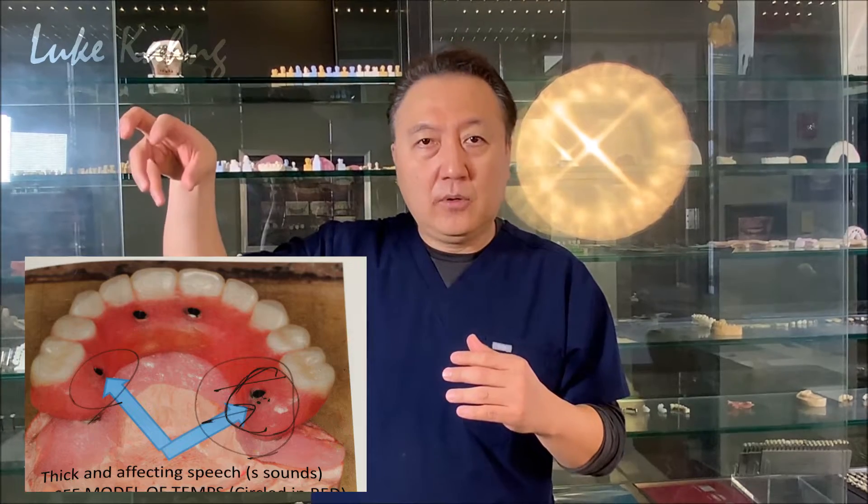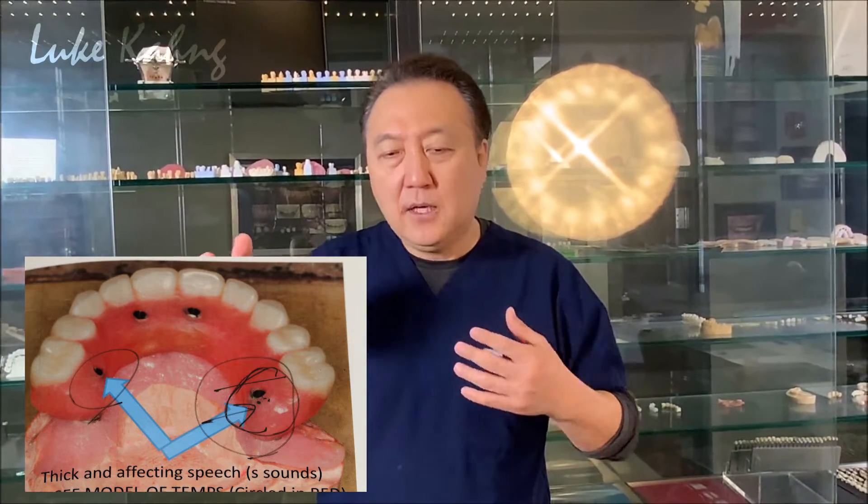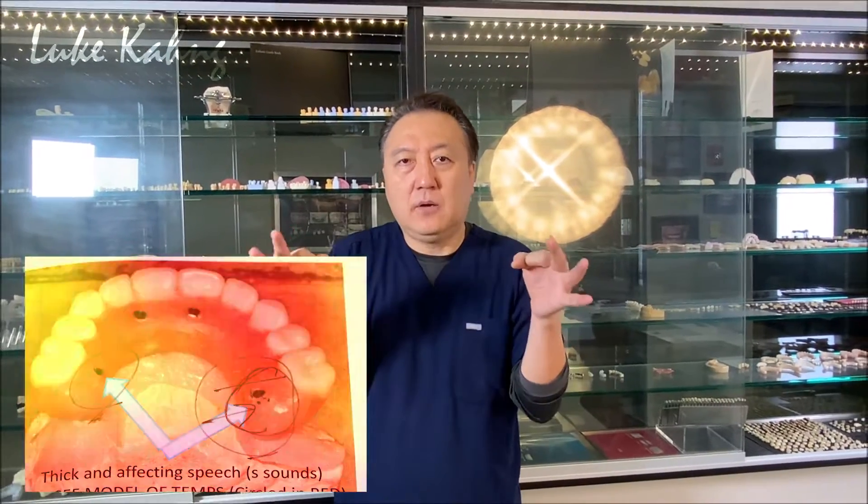When I make the best zirconia restorations, I cut back only a very little — not 1mm, not 0.7mm — only 0.3 to 0.4mm facially and lingually, and then add full porcelain contact. That's how we create natural-looking restorations. As you can see in my photos, in the back where there are implants alone with a big gap, you cannot make those implants standalone with a thin layer — that's another cause of failure.